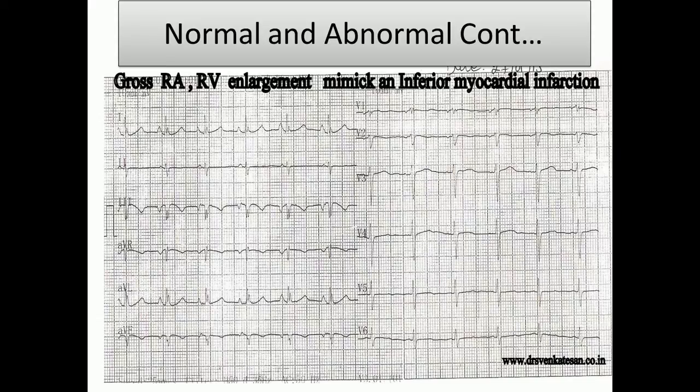As you see here, in lead 3 and lead aVF, we have QS waves, and it is due to right atrial enlargement and right ventricular enlargement, and it should not be mistaken for myocardial infarction. It mimics inferior myocardial infarction, however the coronary is intact by complementary exams.